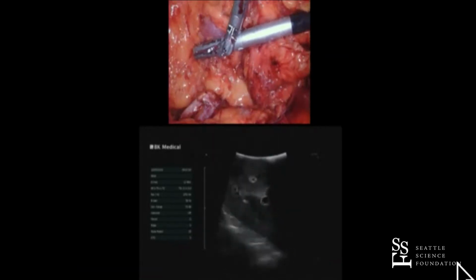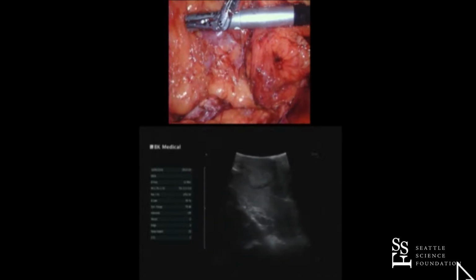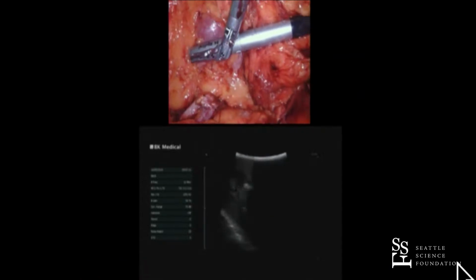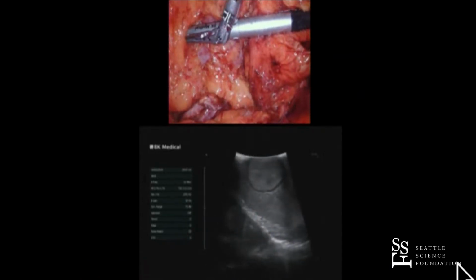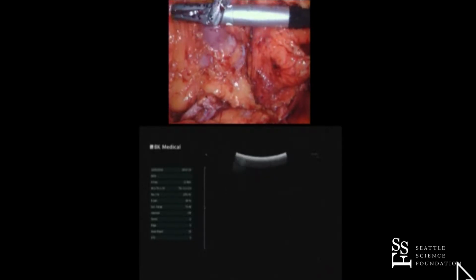We put the ultrasound back pretty far. Can I increase the gain? Can we get 58 or 60 on the gain, please? It looks a little dark. Let's go brighter on the gain. 58 goes to 60? 60. Perfect, okay.